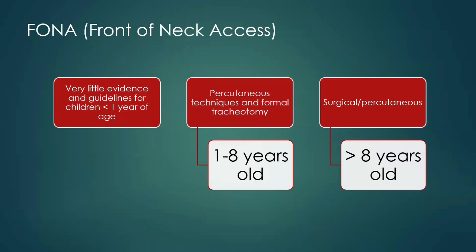You do not have the space to create a surgical incision. You're going to be using needles and threading wires to be able to get into that space. And then for anyone over 8 years of age, you can move on to surgical procedures, but you can still use your percutaneous as well.